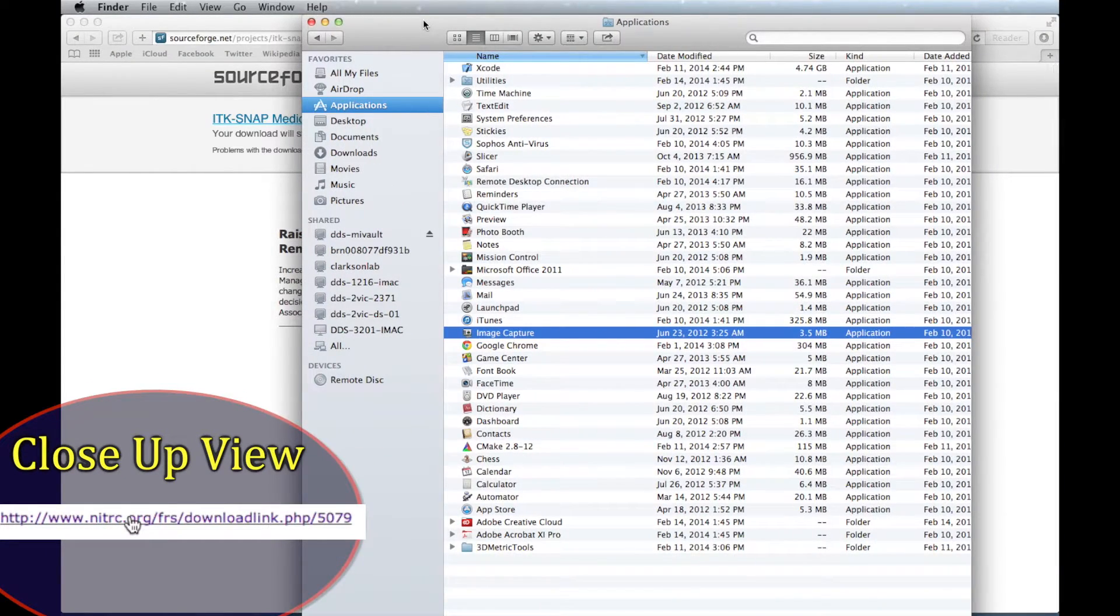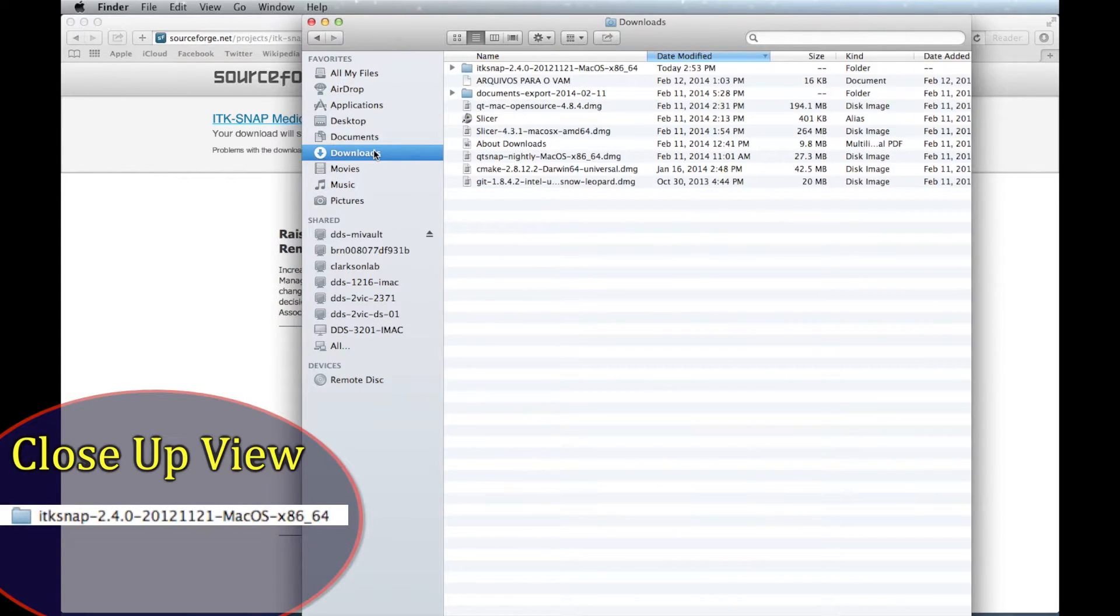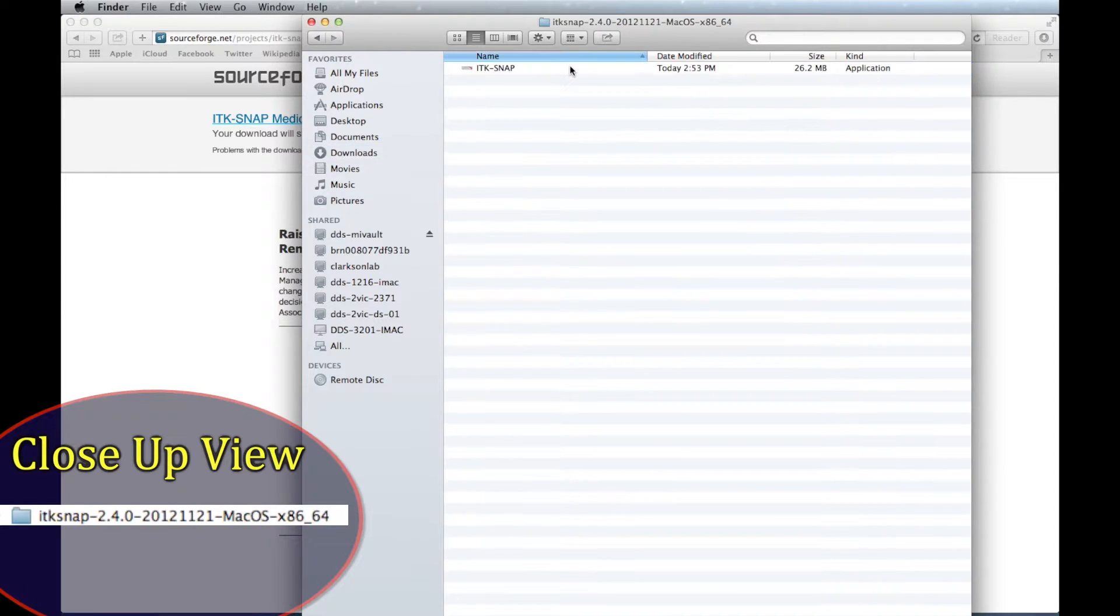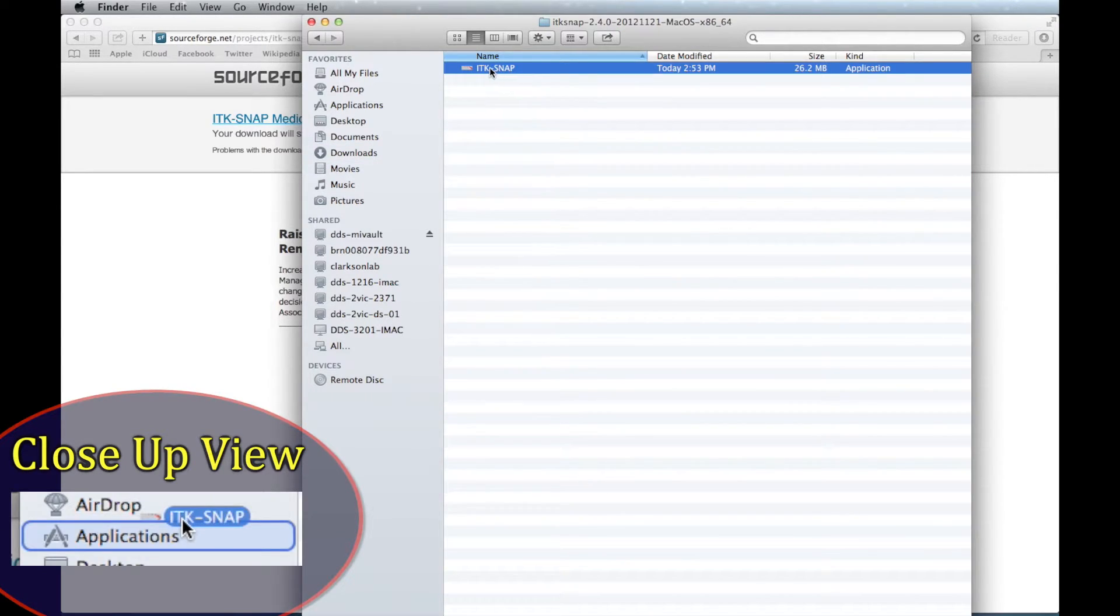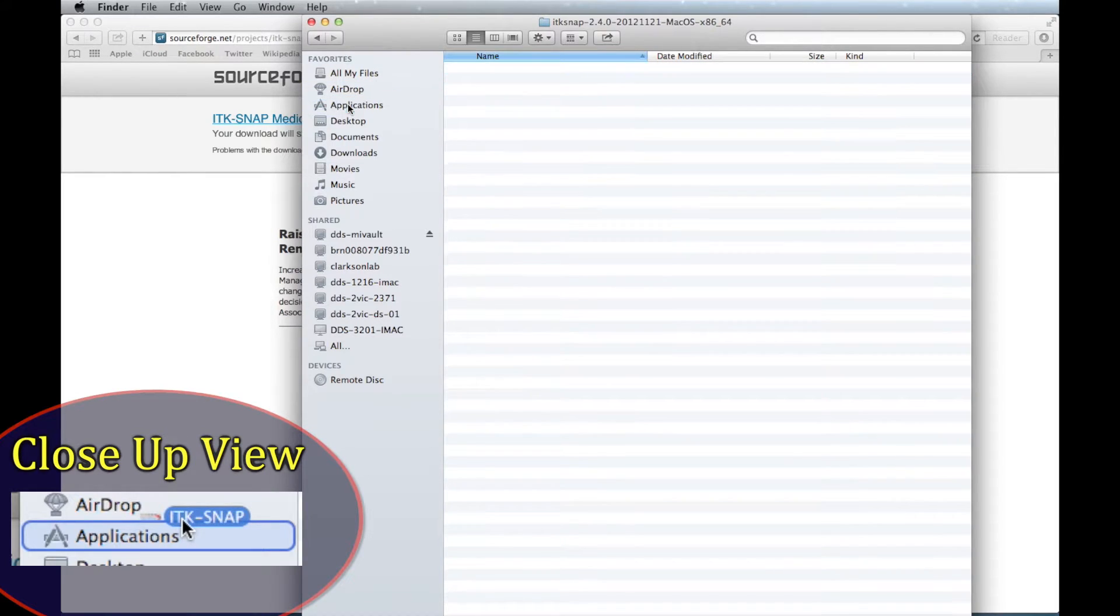On a Mac, locate the recently downloaded application. Click the downloaded file and drag and drop the ITK-SNAP application into the Applications folder.